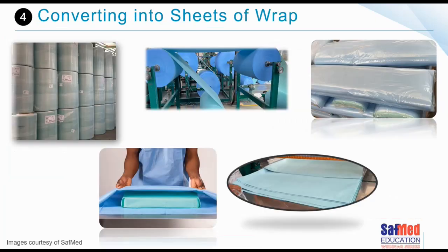Once we've completed the manufacturing, now we need to convert it into the product that we need in our hospitals in the South African setting. So the raw material arrives on a ship, on a rather large container, into South Africa. You can see the image on the left of the raw materials as they arrive, stored in the warehouse. The raw material is then loaded onto a machine that will sheet the material, so cut the wrap into the various sizes that we require.